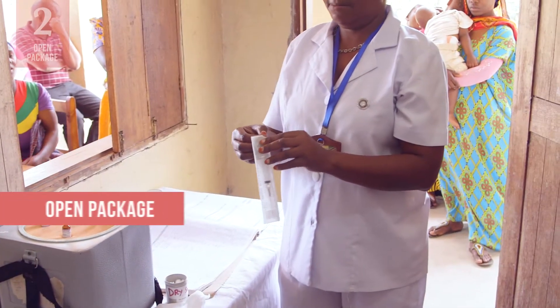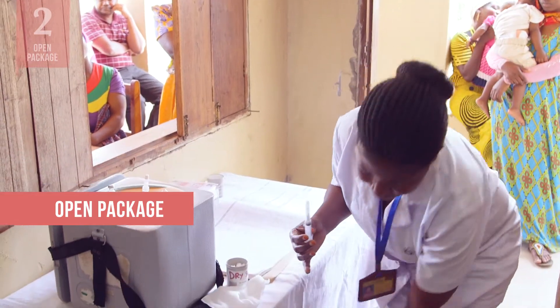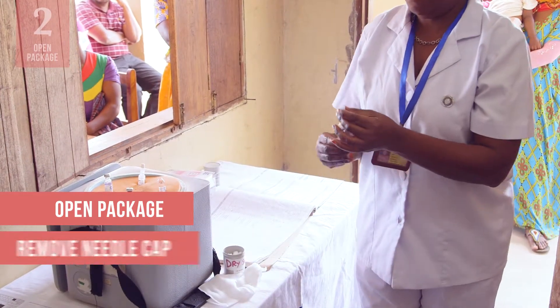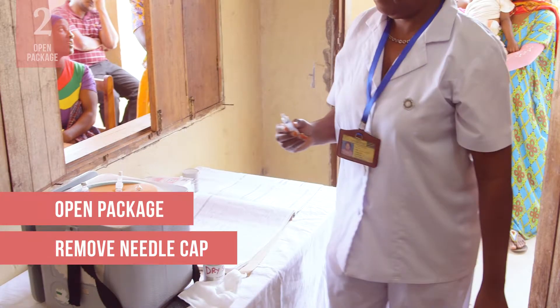Peel the package open from the plunger end to remove the syringe from its plastic wrapping, or you may simply need to detach the plastic cap. Be careful not to touch any part of the needle.